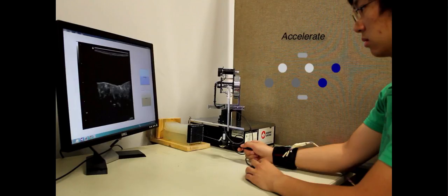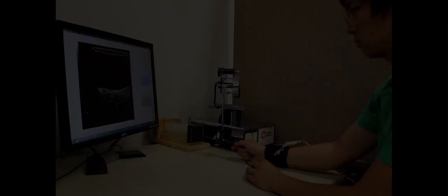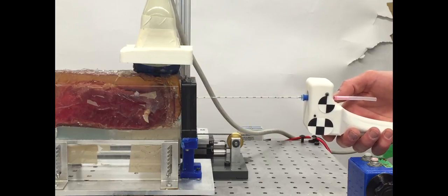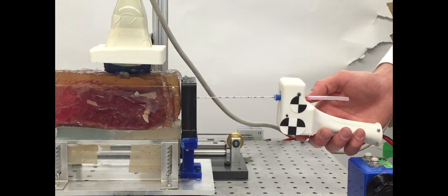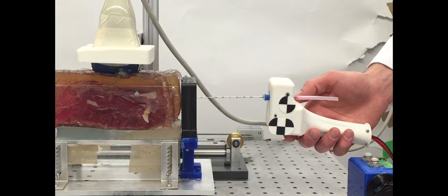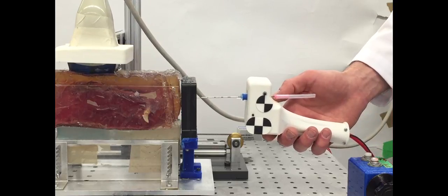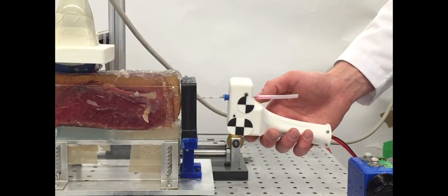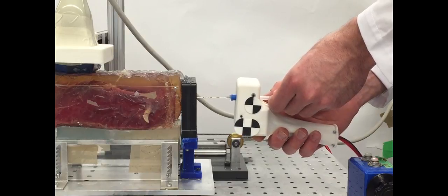During insertion, forces on the beveled needle tip cause the needle to deflect away from a desired target location. One action that can be taken is to rotate the needle base. Rotation forces the needle to deflect in another direction and is the primary method through which a clinician can steer the needle. This handheld device steers the needle for the clinician during insertion to increase seed placement accuracy and reduce tissue trauma. With control of the needle deflection achieved, the seed can now be deposited into the tissue and the needle retracted.